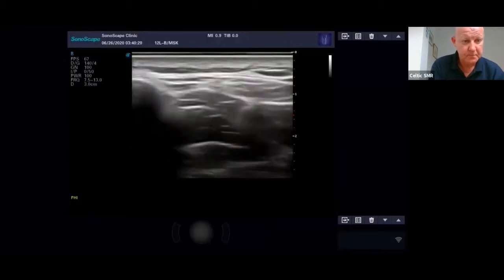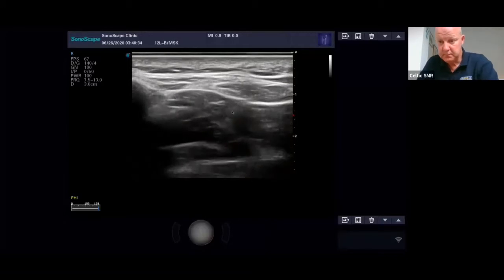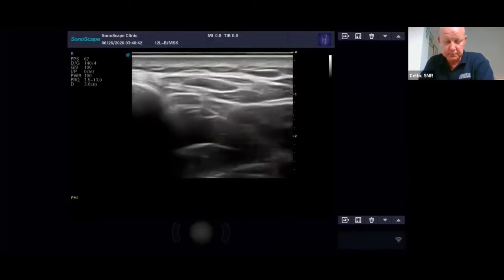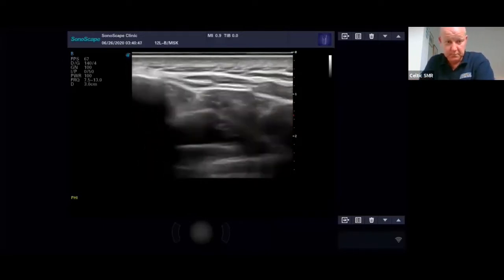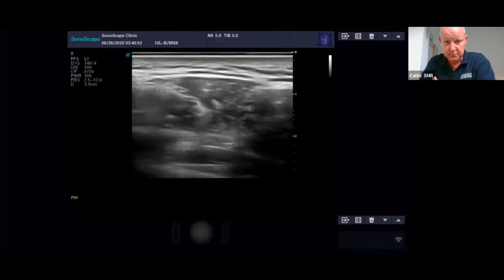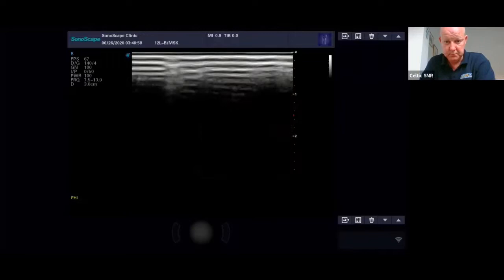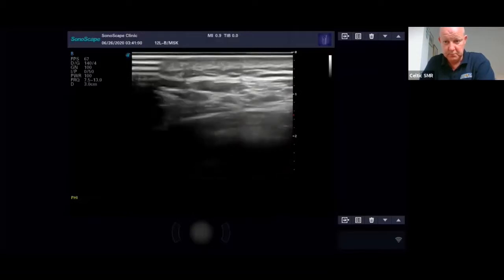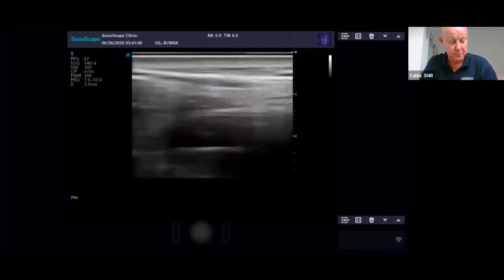If you look at these two here, they're pretty dark. If the supra was really bright, then you could say, oh, there's a little bit of fatty atrophy in there, and that might be an indication that surgery might not go as well. So that's one thing to look at, to tell them how fatty infiltrated the muscle is. And you'll probably notice a bit of atrophy, a little bit of indentation into the back here, where the supraspinatus muscle is.